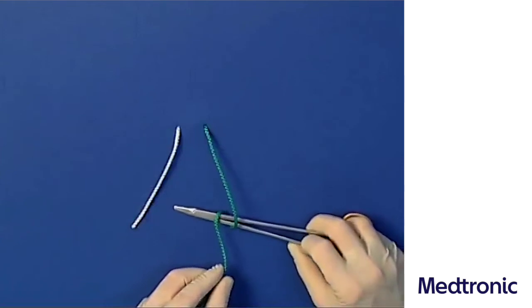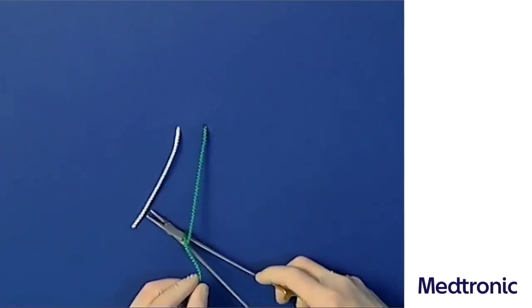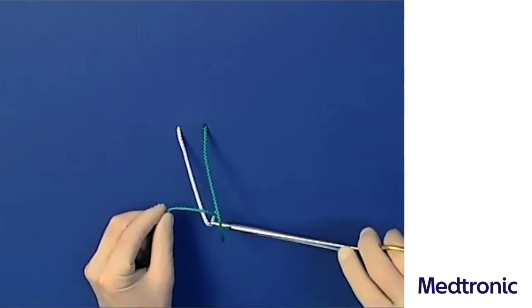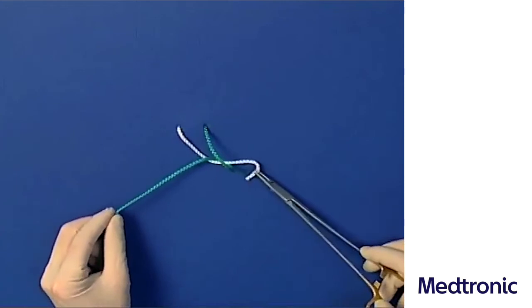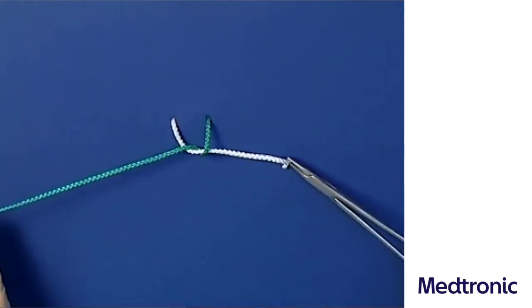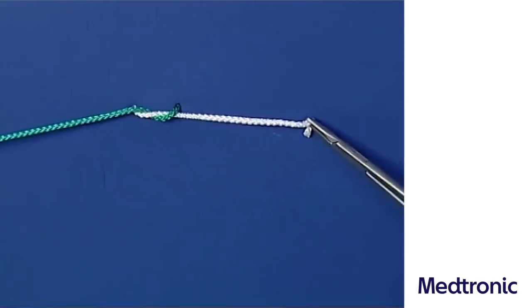The short suture end is grasped and pulled through the produced loop. By pulling the right long suture end to the left and the short suture end to the right, the first loop is completed.